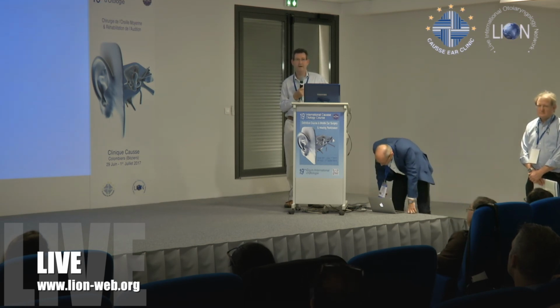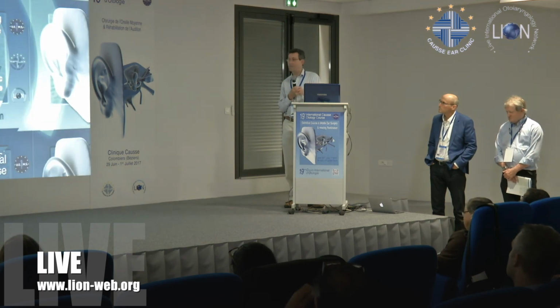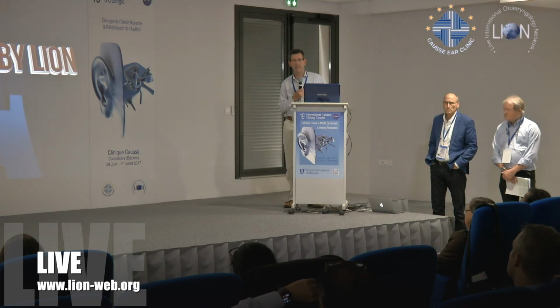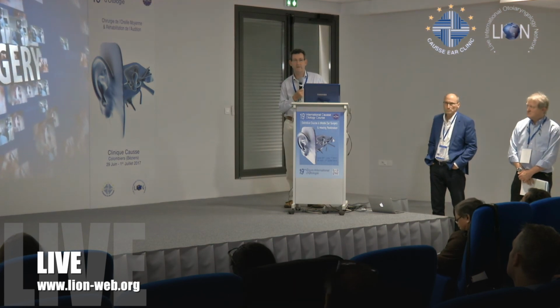I understand. But my understanding is that the piezoelectric system does have a better high frequency output than the electromagnetic systems. Right. And that's true, very promising, I think. Their problem is usually getting low frequencies with piezoelectrics. The high frequencies are easier to get, and piezoelectrics by definition do well at high frequencies but have trouble at low frequencies. But you can change your resonances and things.